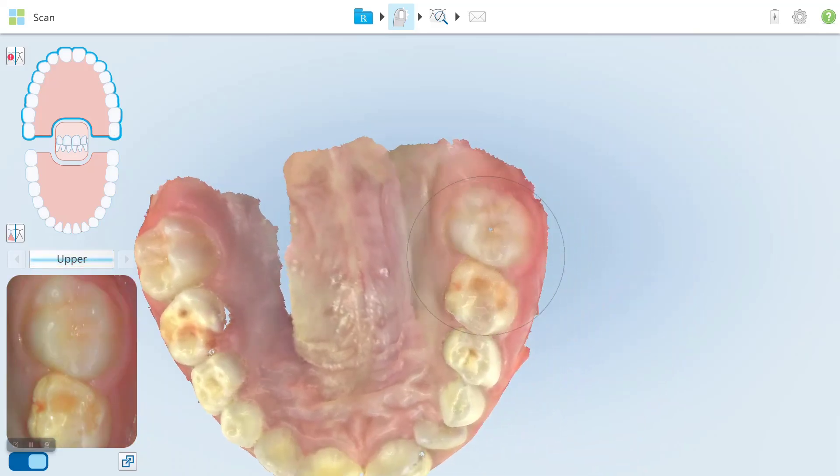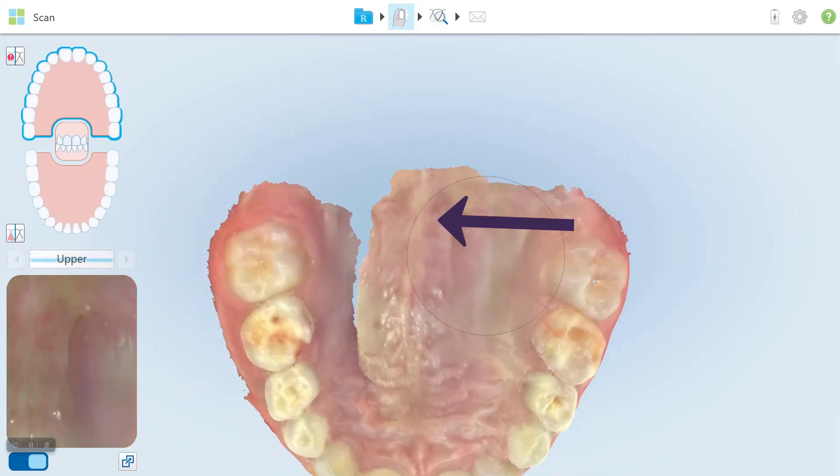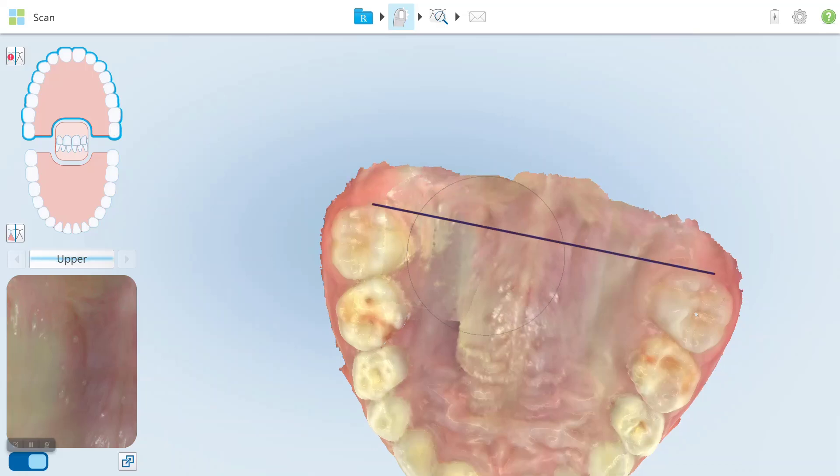Scan from the palatal surface of the permanent right molar across to the midline, following the curvature of the vault. Then scan across to the midline following the curvature of the vault on the other side of the palate, ensuring a line between the permanent molars is reached.